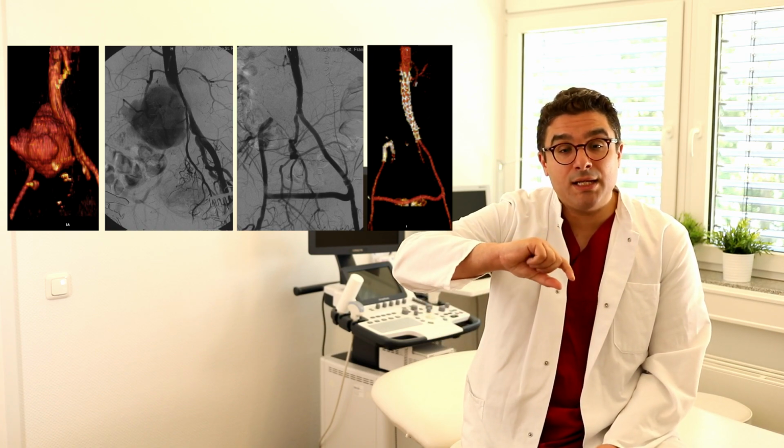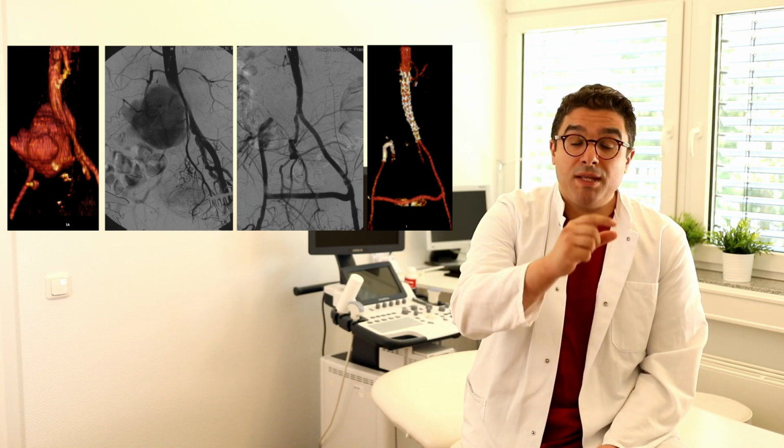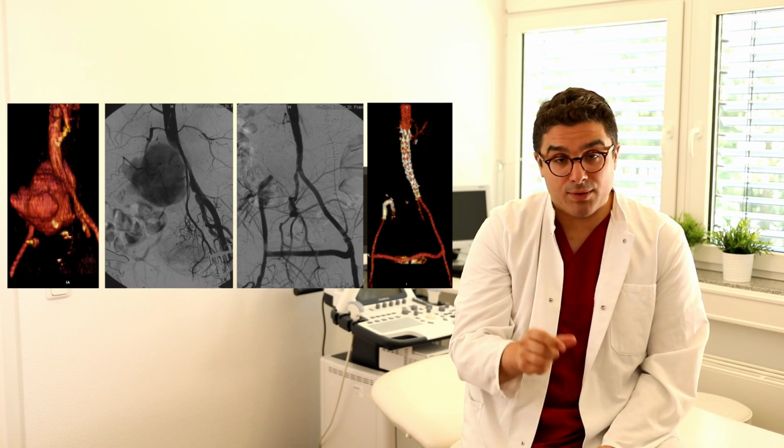That means implantation of a very flexible stent graft, for example the Viabahn endograft, between the external iliac and the hypogastric artery.